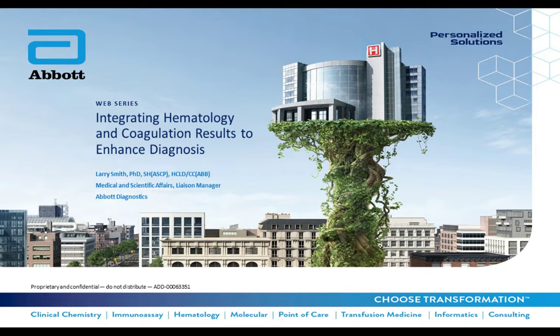Again, I would just reemphasize that just because the platelet function screen is normal, there still could be a platelet abnormality that would be identified through platelet aggregometry. So it really depends on the clinical condition that you're looking at and what the patient is actually presenting with.